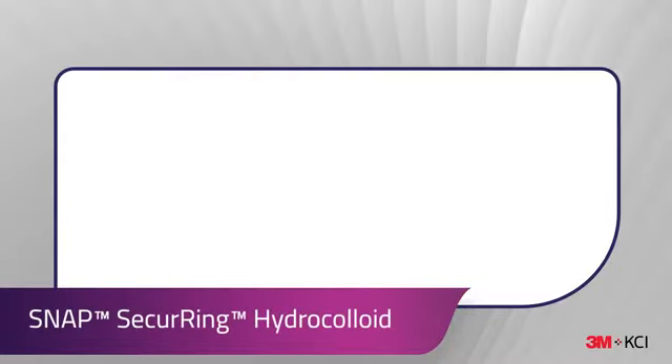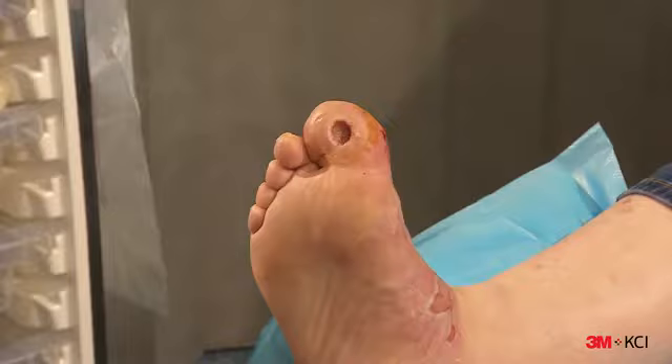For this application, the Snap Securing Hydrocolloid was utilised to help create a seal on a challenging body contour. Before applying the Snap Securing Hydrocolloid, be sure the skin is clean and dry.